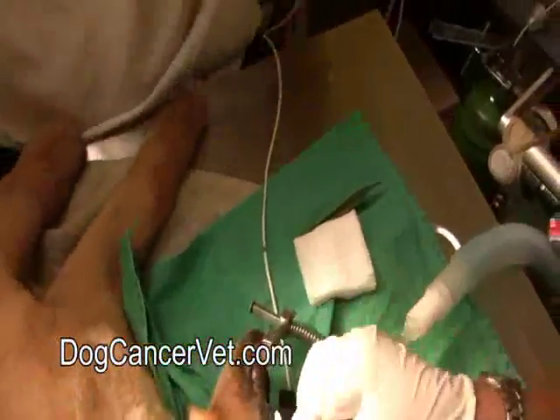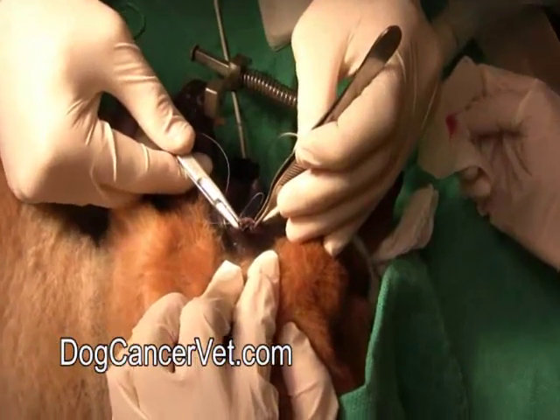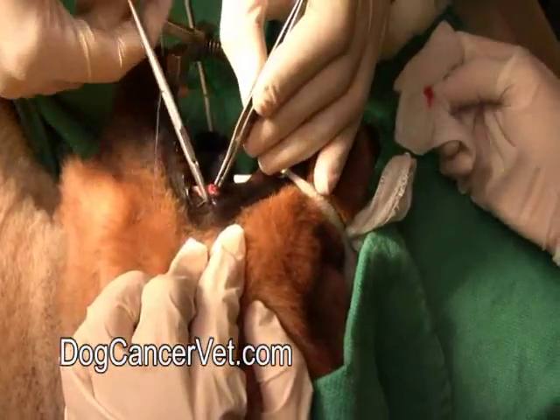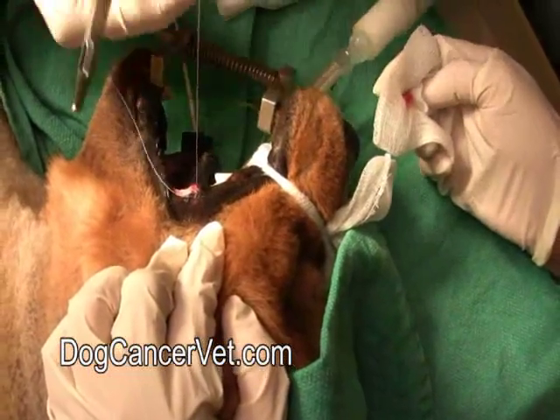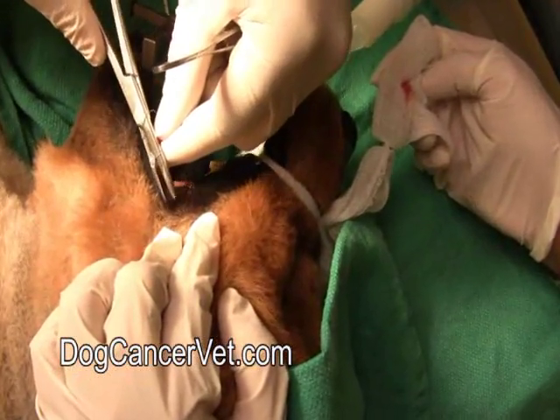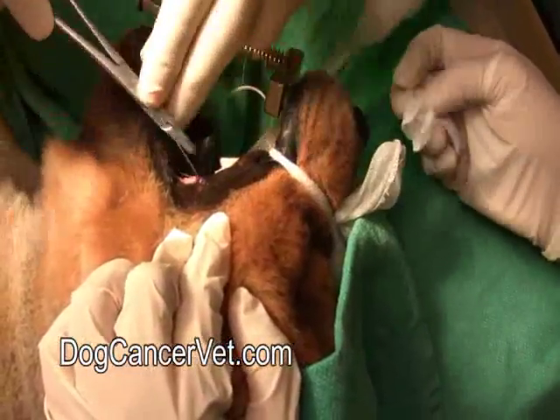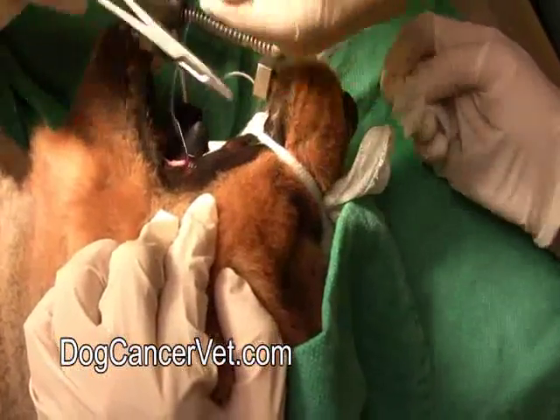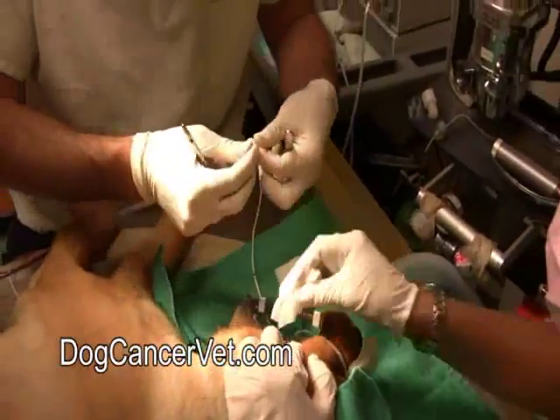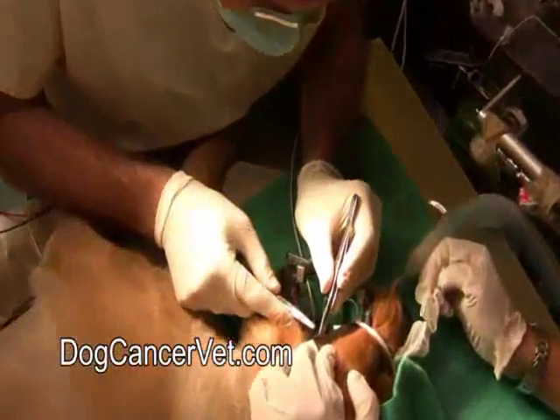I'm just going to dab it off a little bit there because there's a small amount of blood. And I'm choosing a suture material here that'll get absorbed by the body, and the reason for that is I don't want to have to go back in and take these stitches out because it's not very fun for the dog. So I'm just going to use this stuff called Vicryl, and the body will break this down in about 6 weeks, and we won't have to deal with any suture removal. Sometimes you can use an absorbable suture and sometimes you can't. It really depends on the area that's being operated on.